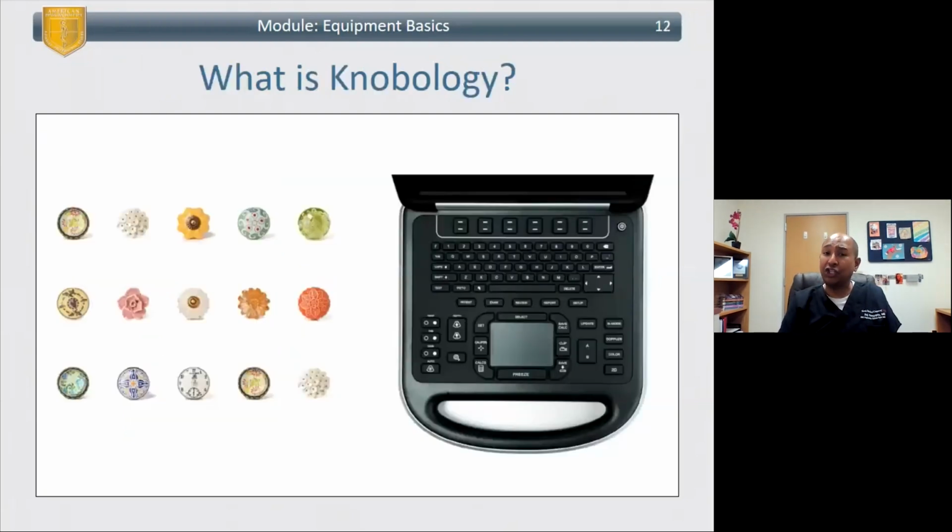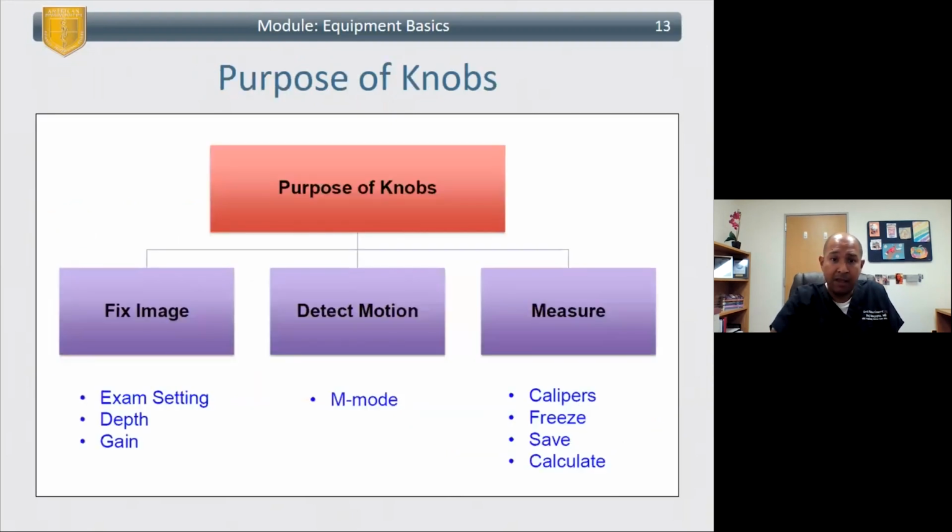So what is knobology? Well, I swear I thought this word was made up, but I went to look it up on Google, and so many people have done presentations on knobology, and it is what it sounds like: looking at the different knobs on different devices. I put a picture here of the ultrasound machine that I use most commonly. But like I said earlier, you definitely want to be familiar in a practical sense with the ultrasound that you have in your office or in your ICU.